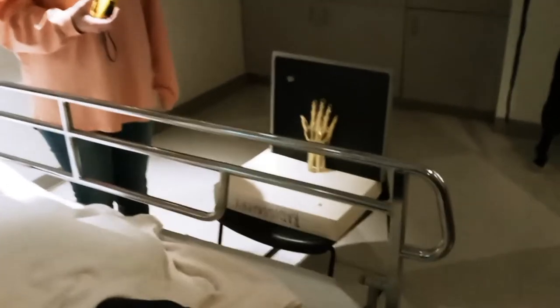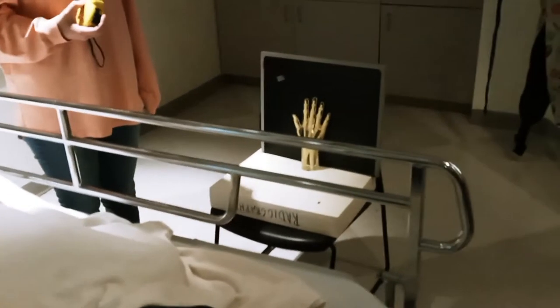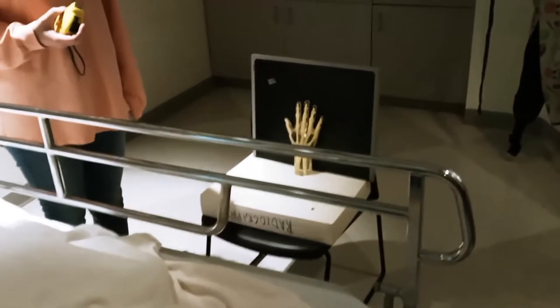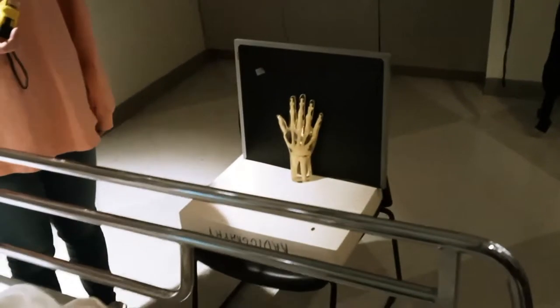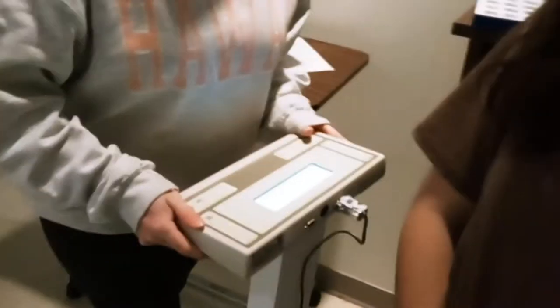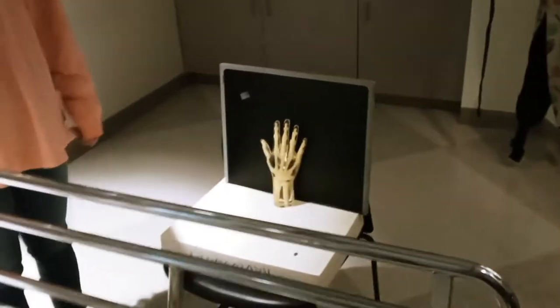Okay, so what have we got going on here, Ms. Bianca? You're on the control panel? Yeah.